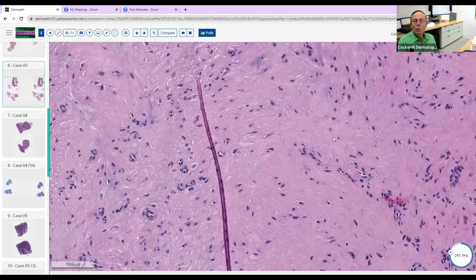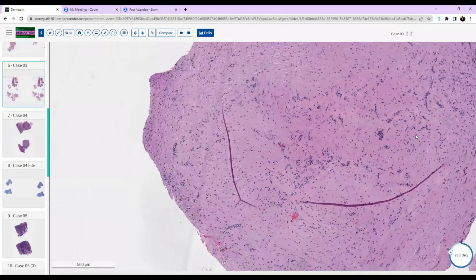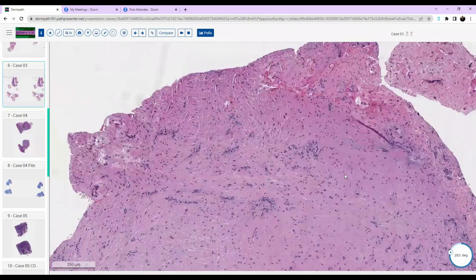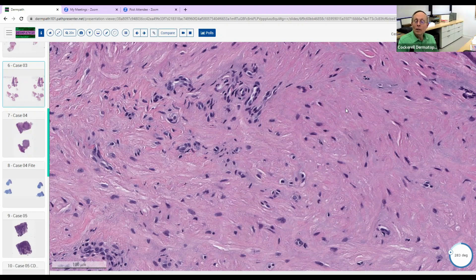Yes. So what's your differential diagnosis of this? I also appreciated that there seem to be some vascular structures as well. So I was favoring angioleiomyoma, but within that differential, there's also things like dermatofibromas or neurofibromas. But if we're saying this is smooth muscle cell, those would be less likely. So you think this is all smooth muscle here? I did, yes.